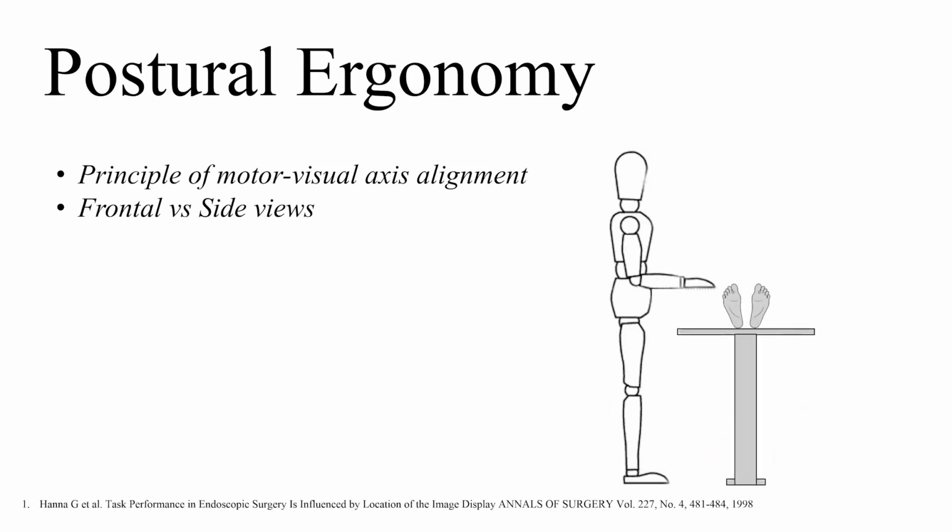Also, when in frontal view, hand-level gaze-down viewing again resulted in shorter times and increased performance scores when compared with the eye-level frontal view alone.